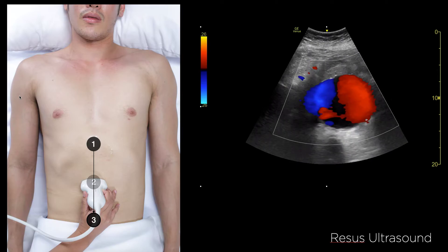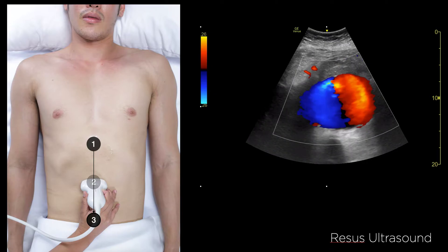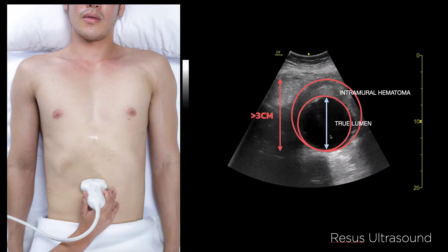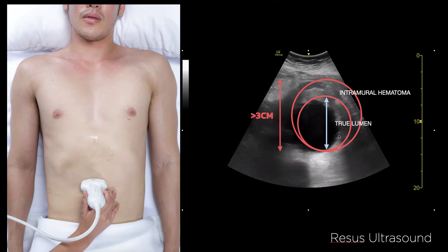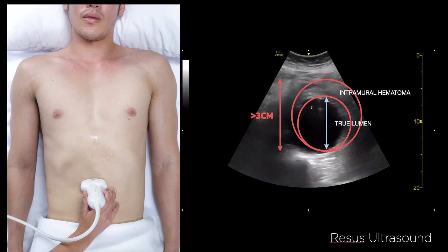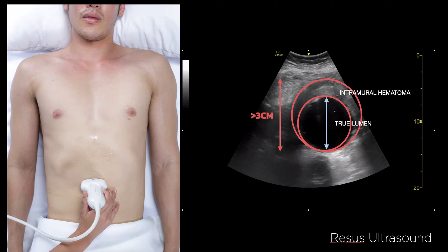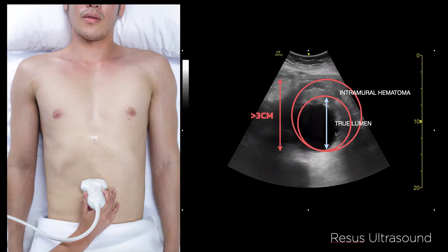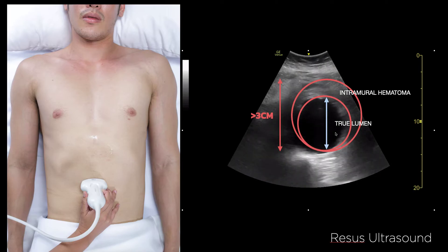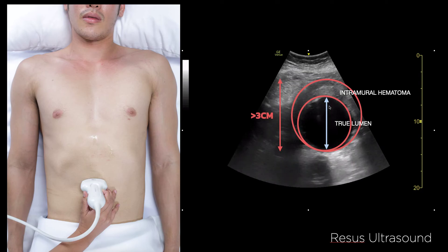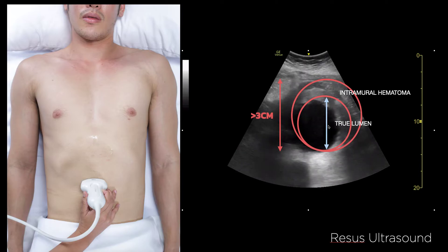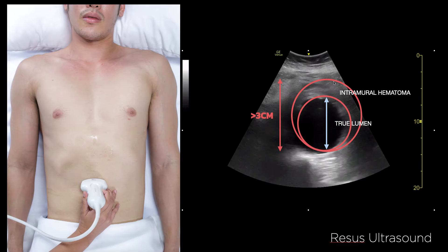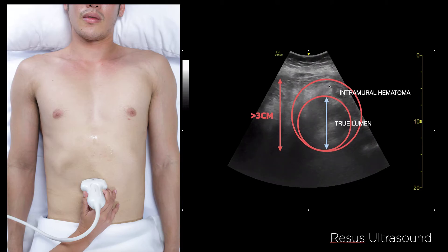The last thing is how to measure it — this is something people miss a lot. You need to measure from outer wall to outer wall. The cystic structure you see on the inside is actually the true lumen, which is not the full aorta. If you measure only the inner lumen, you will get a smaller diameter than the actual aortic size.